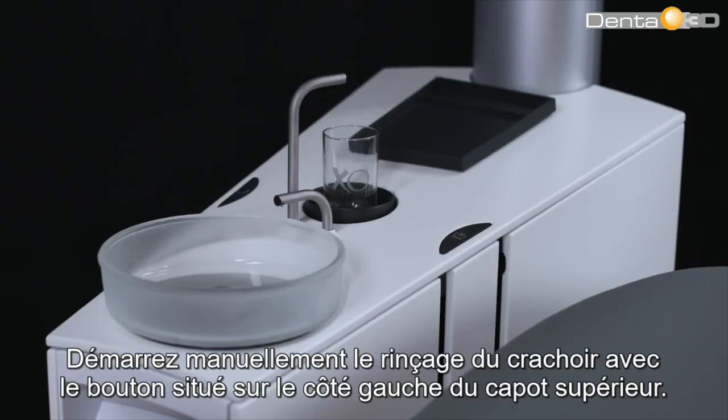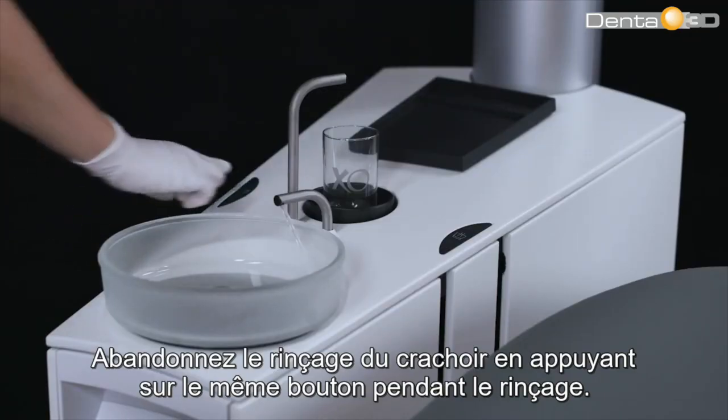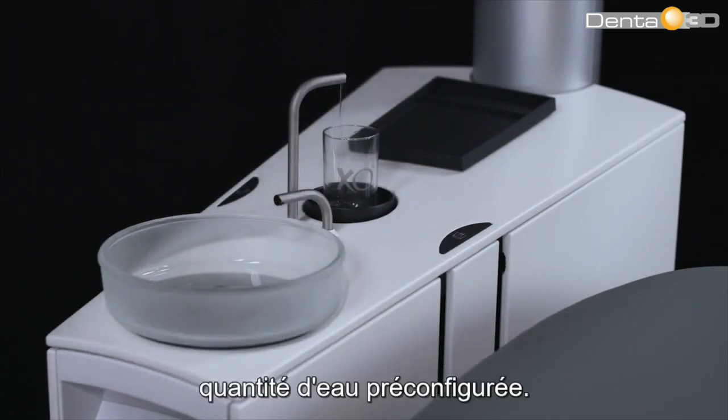Start the cuspitor flush manually with the button on the left side of the top cover. It will stop automatically after the pre-set rinsing time. Abort the cuspitor flush by pushing the same button while rinsing. Push the button on the right side of the top cover for less than one second and the glass will fill with the pre-configured amount of water.